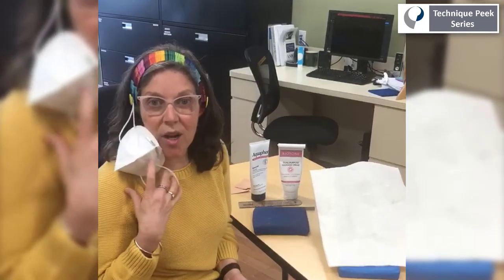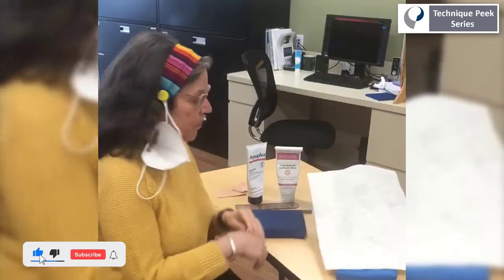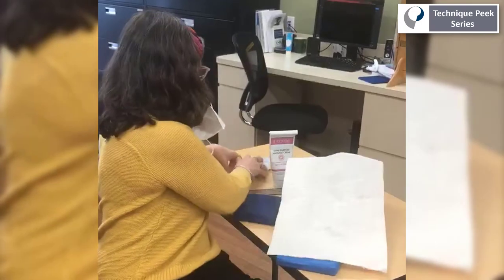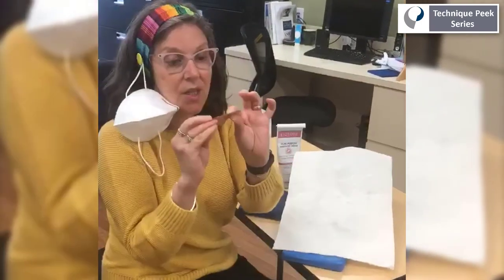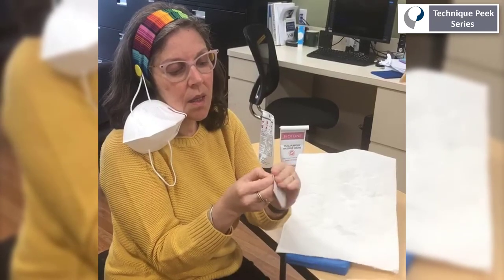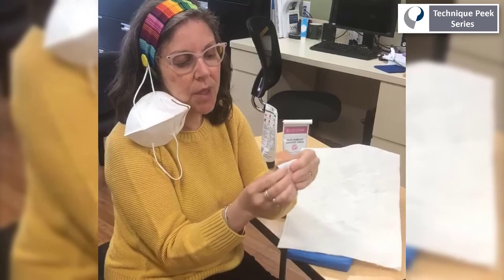Hi, today I'm going to instruct on how to kinesiotape a CMC joint arthritis to decrease pain. Luckily I have it on my hand so I'm going to use my hand to demonstrate it. You take a piece of kinesiotape, you open it up a little bit here, so you have a little piece showing.